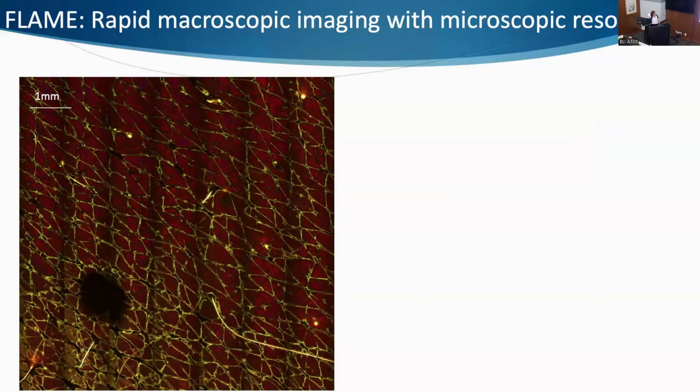So first, I wanted to show where this large field of view is most useful, because we can do this macroscopic imaging with microscopic resolution. It's very important for these types of applications in clinic, for studies where we need to monitor treatment.